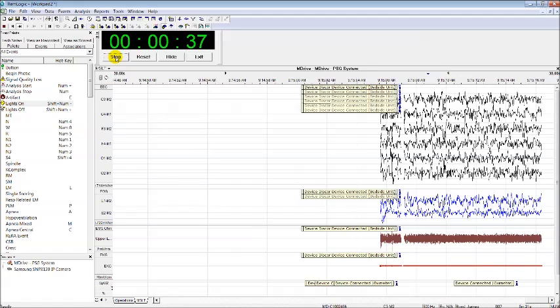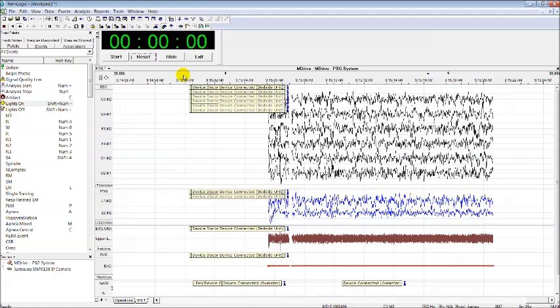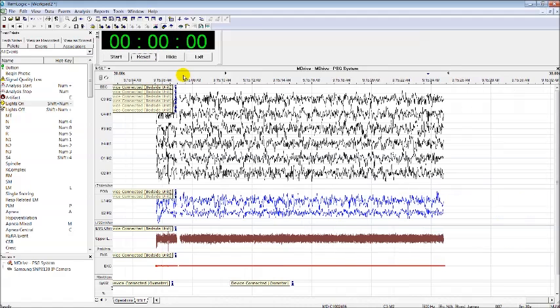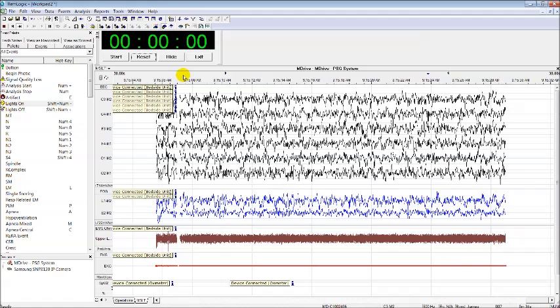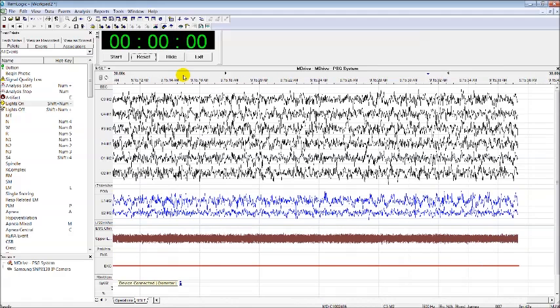Okay, we are back on. So I'll just stop the timer and reset it. Then the same steps again: we will do the patient biocalibration, followed by the instructions for patients, the same standardized instructions, and then lights off, and then you can go into the scoring mode again.